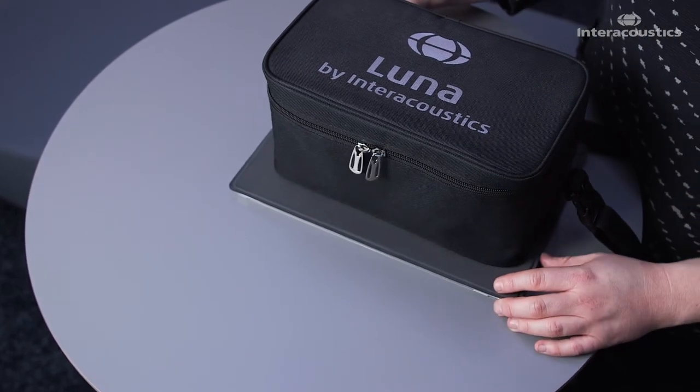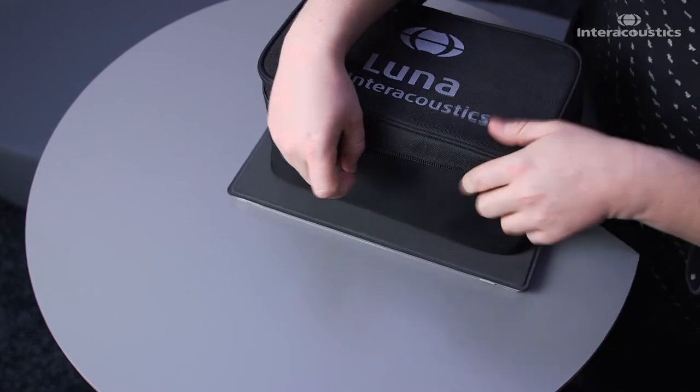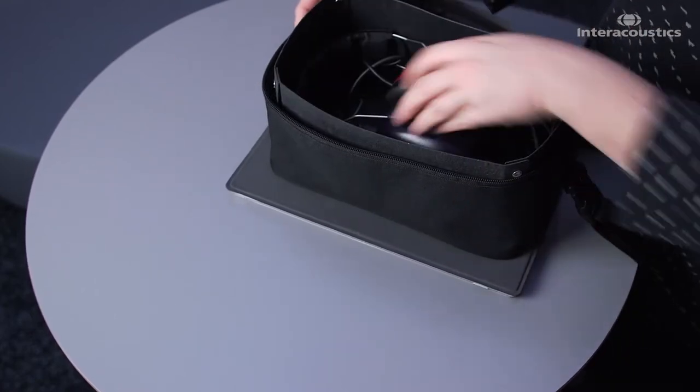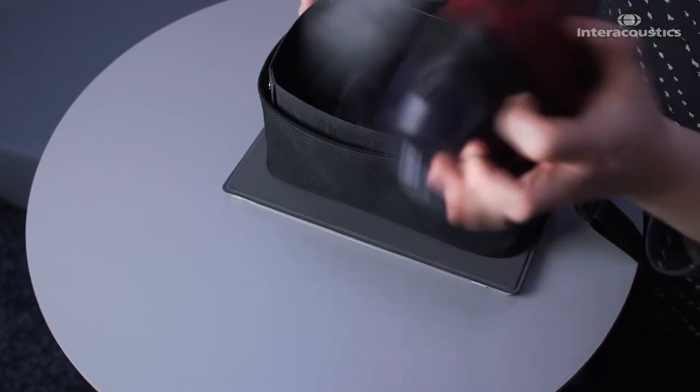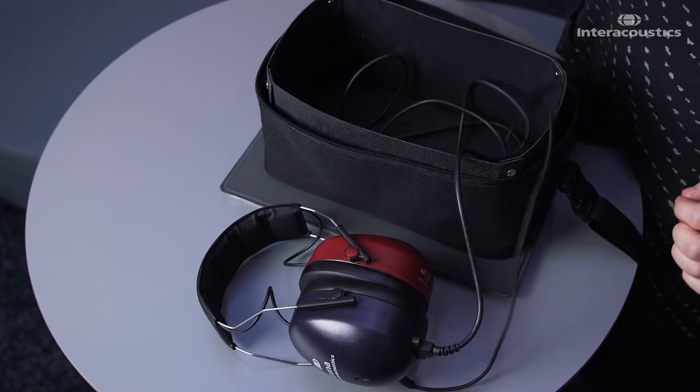LUNA is an audiometer headset by Interacoustics that can be taken out for screening environments in schools or workplaces. The LUNA audiometer headset consists of the headset itself and a patient response button that is connected to the headset.